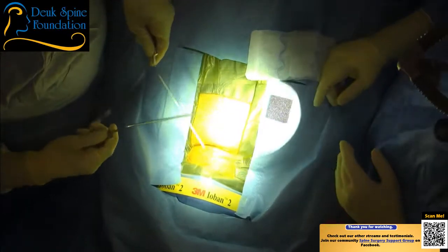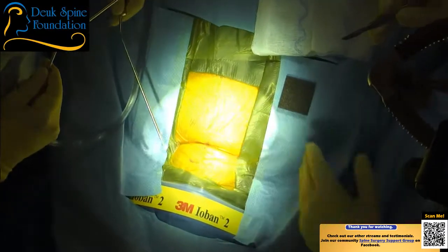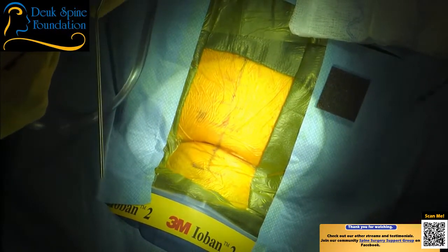All right. So this patient has multiple levels of narrowing and pinching of the spinal cord and nerve roots. And so we're going to go in there today and unpinch the nerves and spinal cord. That's our primary goal.